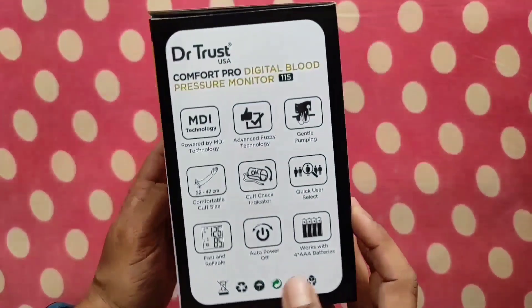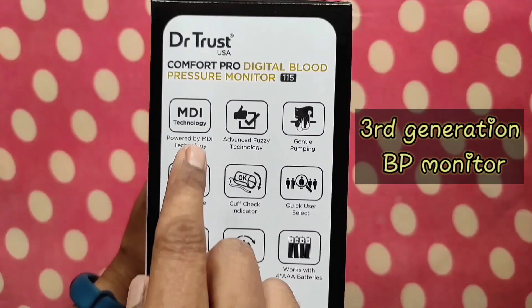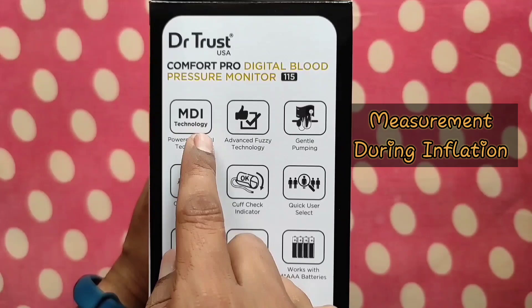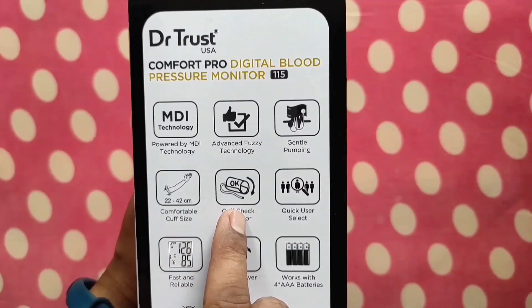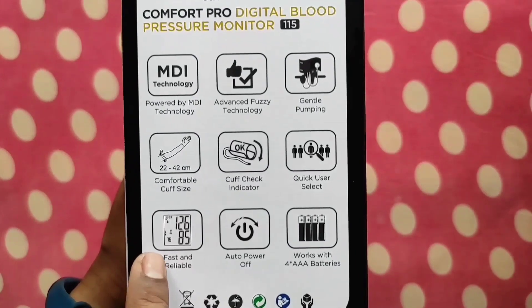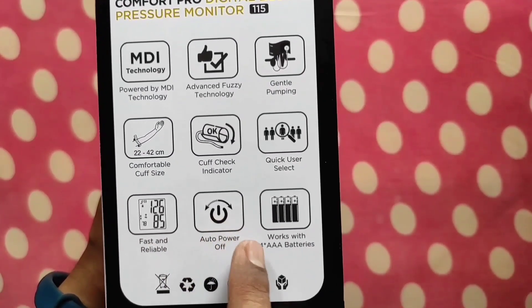I will tell you why you should choose this BP monitor among the several BP monitors available in the market. This is a third generation BP monitor with MDI technology — measurement during inflation — with advanced fuzzy technology, gentle pumping, comfortable cuff size, cuff check indicator, quick user select, fast and reliable measurement, auto power off, and it also works with 4 AAA batteries and USB.